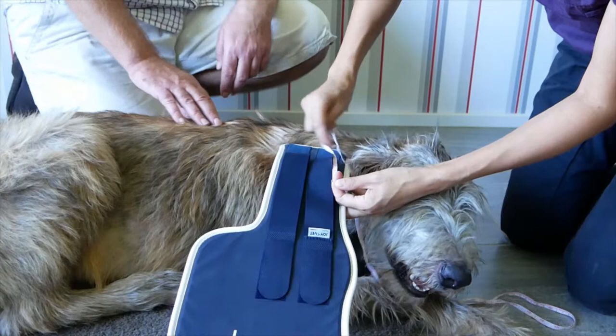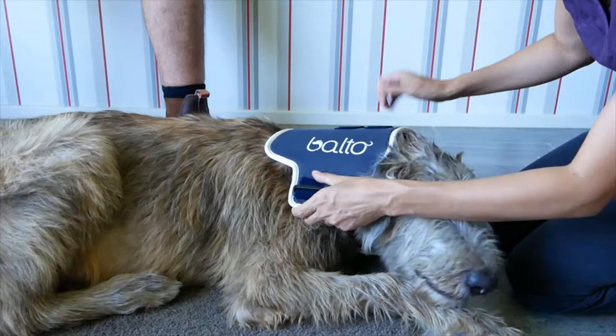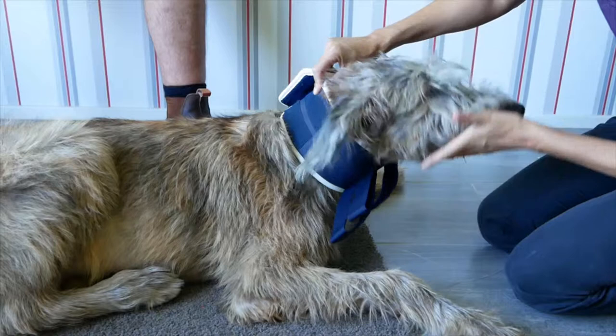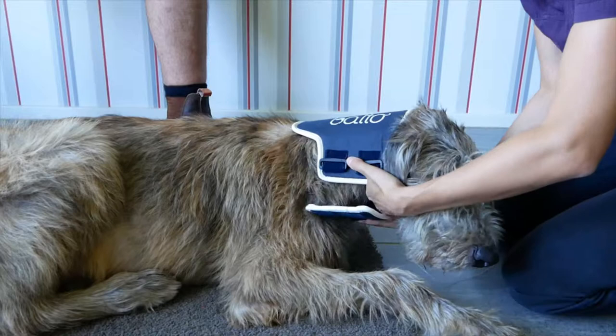The neck brace can be placed dorsally or ventrally according to the type of neck support needed and the specific condition of the patient. Both positions provide a good neck immobilization. However, the dorsal position focuses at preventing dorsal extension, lateral and medial neck flexion. Conversely, the ventral position provides support for the head to rest on and relax the neck muscles, or to stop the dog accessing or licking their wound post-surgery.